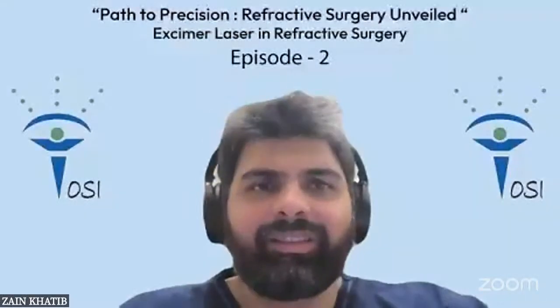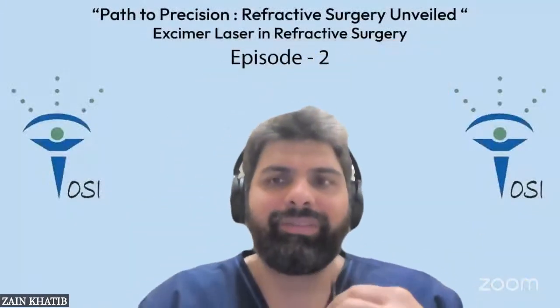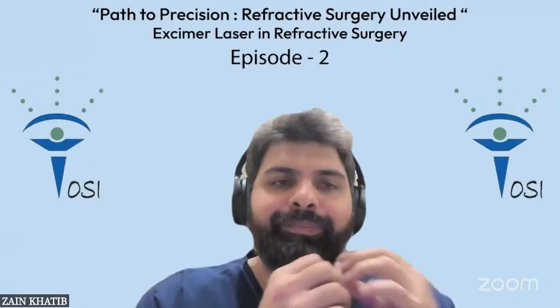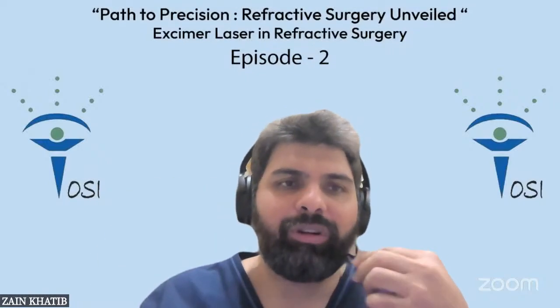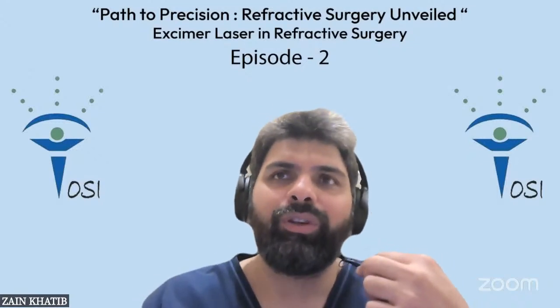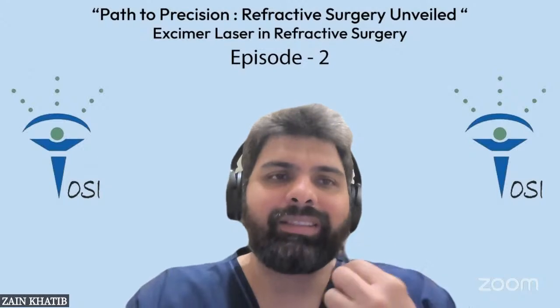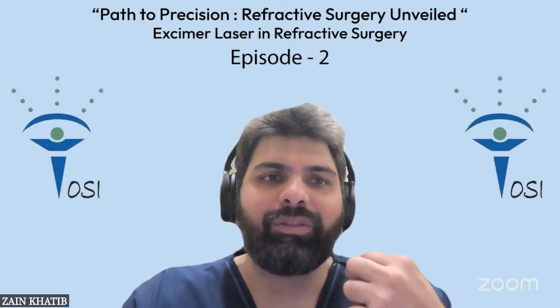Thanks, Dr. Lippy. Very elaborately described. You showed a very good microkeratome LASIK as well. So, before we take comments from Dr. Pooja, a couple of things: related to the flap repositioning, that is something extremely important in LASIK, which I think was missed over there.